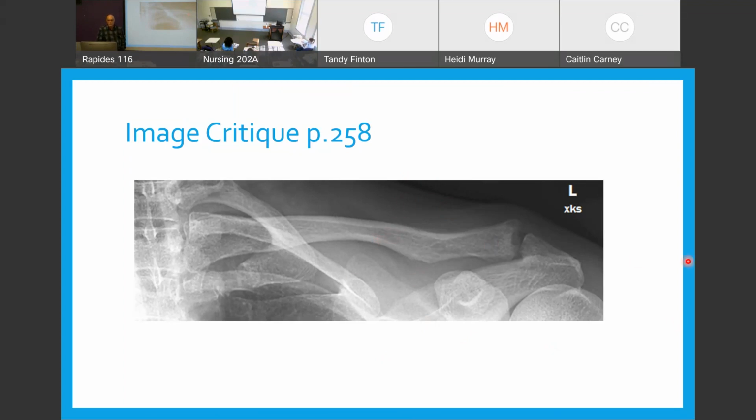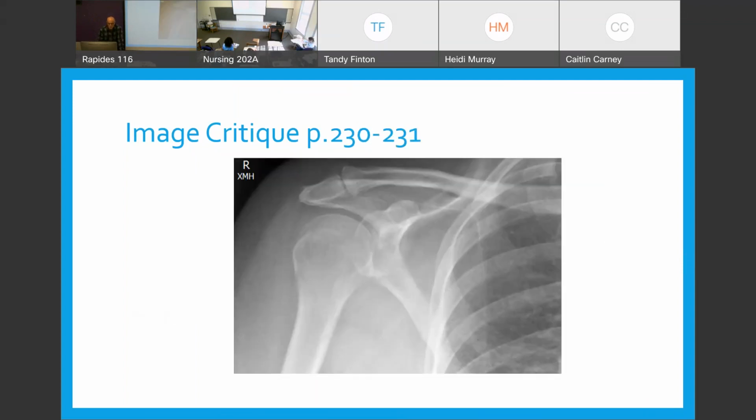Okay, what if the patient is not in lordotic and they're standing? 30. What if they're supine? It would still be 15 to 30. 15 to what? 30. 30, yeah. All right. Thinner patients require more or less? More. Very good. All right.